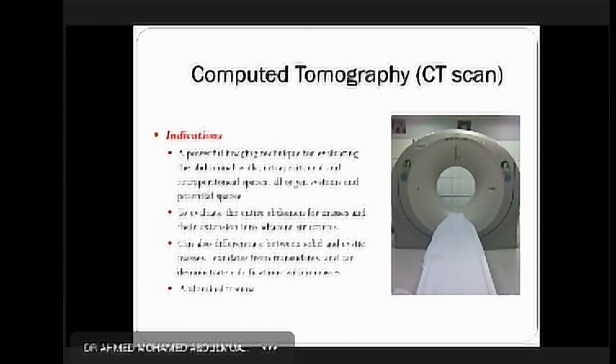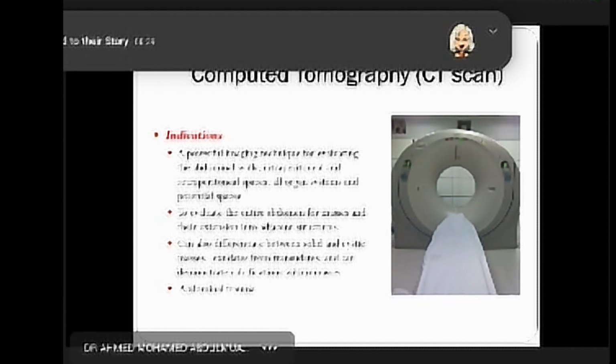first of all, you should know how to prepare your patient for CT scan. Whenever you have CT scan, CT abdomen always will be carried with contrast, which is like 150 cc of contrast. So first of all, we should make sure this patient is not asthmatic, or he's not having any allergy, like allergy to medication or to food or anything. So whenever your patient is asthmatic or allergic, we have to cover him with steroids, which is 40 milligram, 12 hours before the examination, another 40 milligram, 2 hours before the examination to cover him, okay?